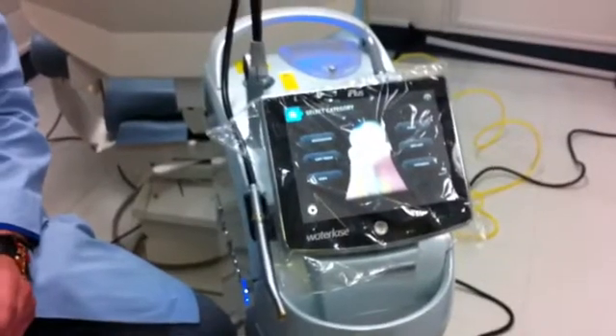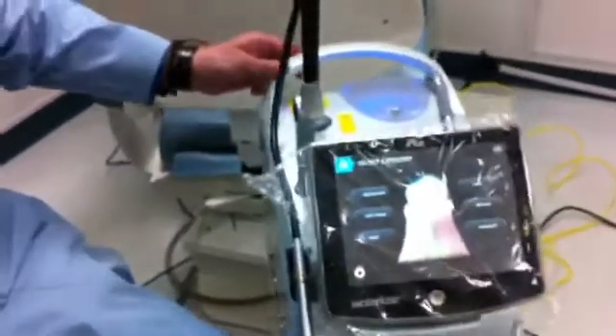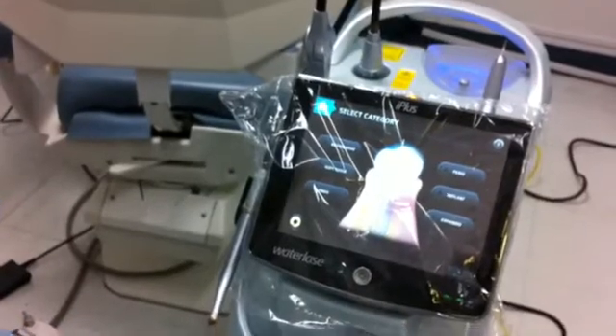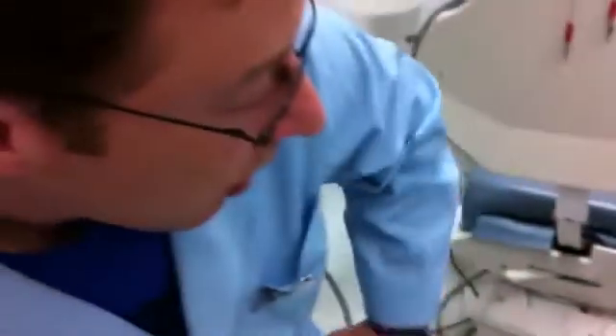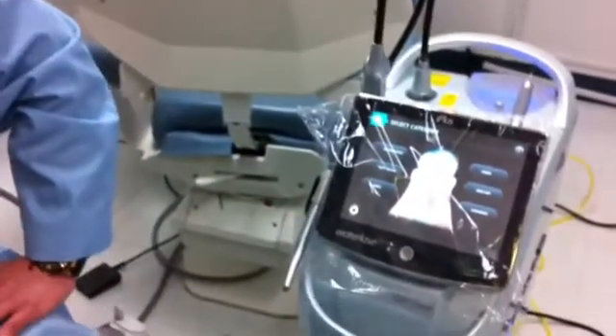I'm pretty happy to get that new machine. I have a previous waterless machine — it was great — but this is definitely much more powerful and easy to work. The full screen is comfortable to deal with all procedures. You can see everything right there. It's going to take some time to get comfortable operating the machine, but overall it's really great.